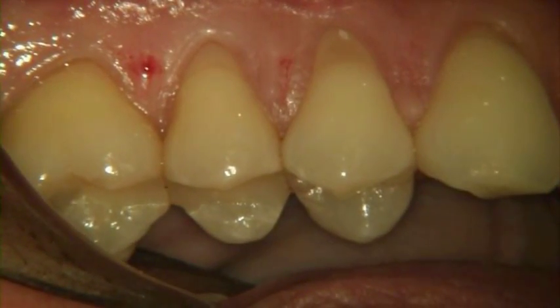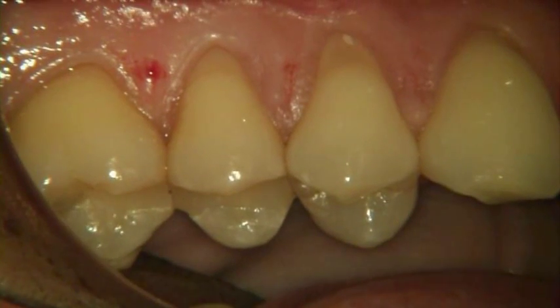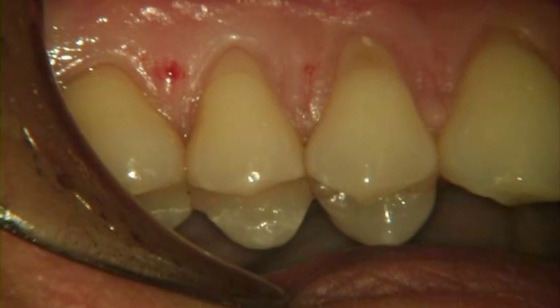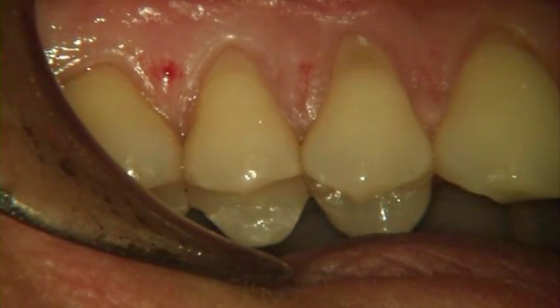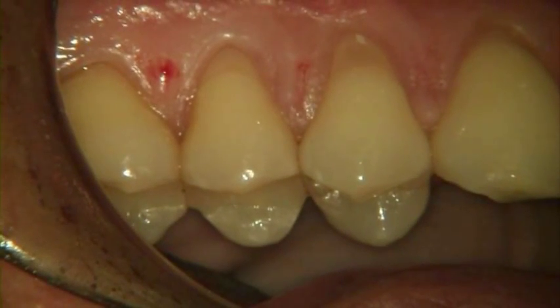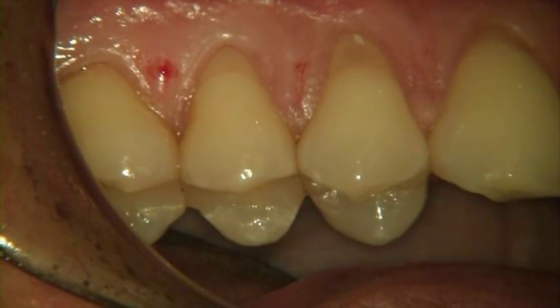The patient presents with Miller Class I recession defects of the maxillary right first and second premolar teeth, with limited amounts of keratinized marginal gingiva. Because of the inadequate zones of attached gingiva, the marginal tissues remain inflamed in spite of excellent home care.